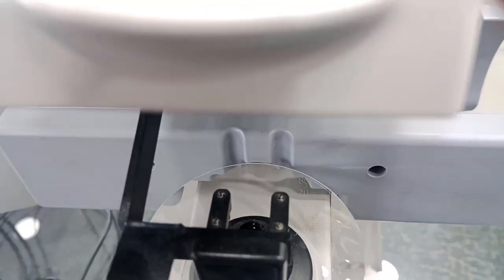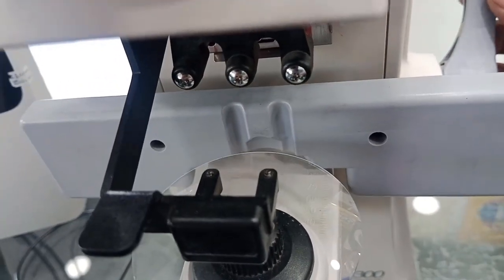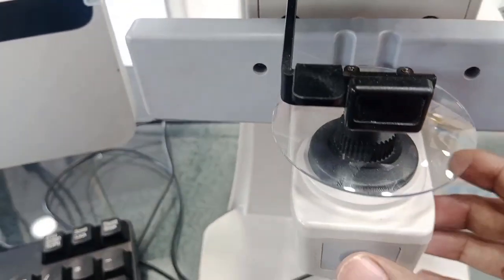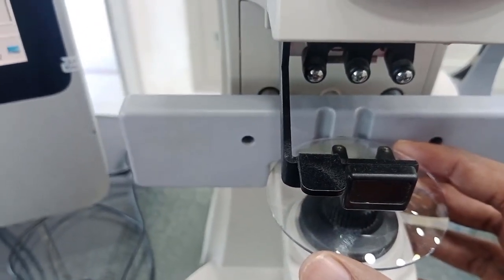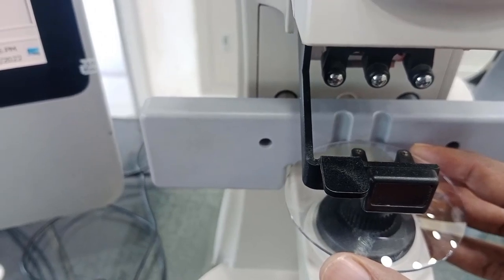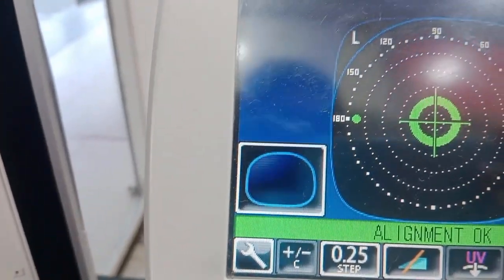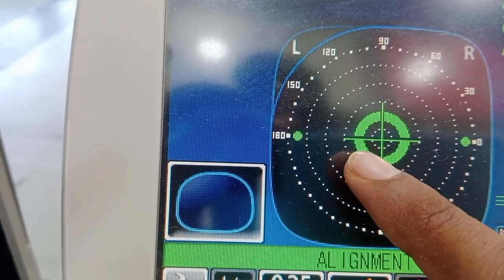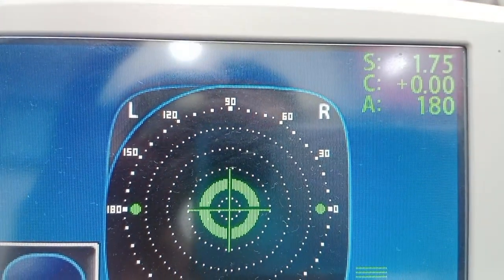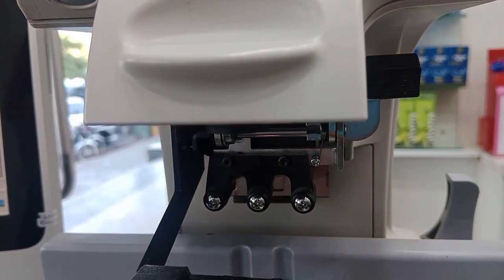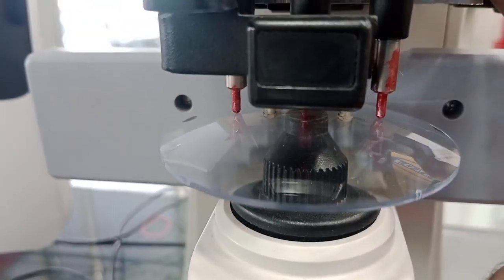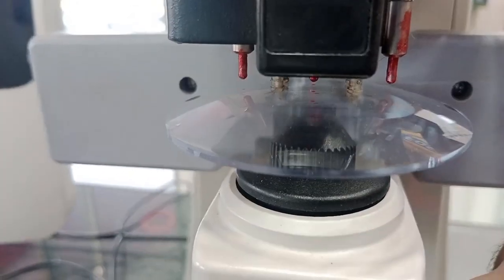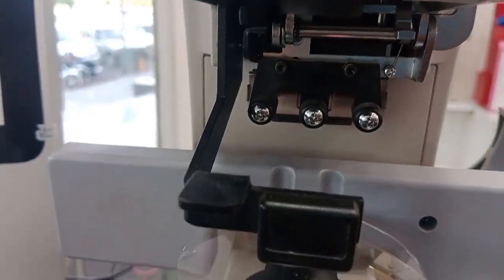Our lens blank is well adjusted with the help of the lens holder and lever. The optical center is properly aligned and well centered. The power is plus 1.75. You can mark your axis if needed or find the optical center, and we have marked our three dots on the surface of the lens.